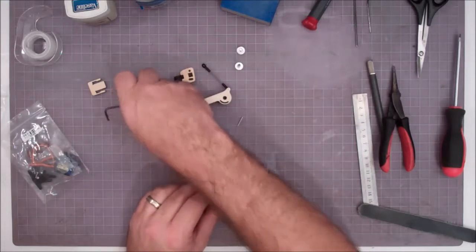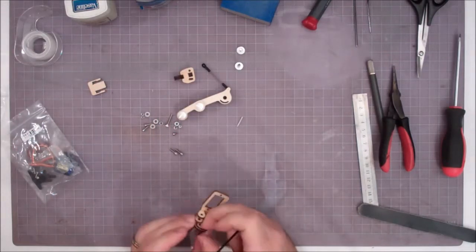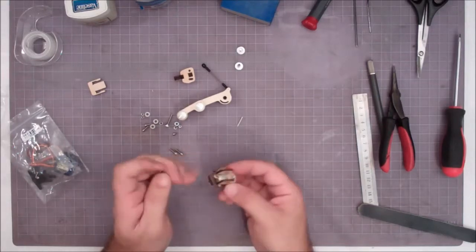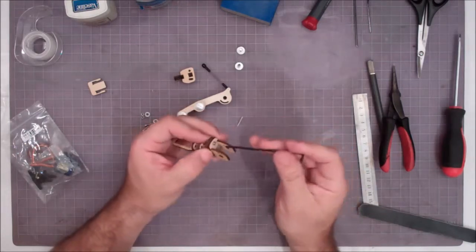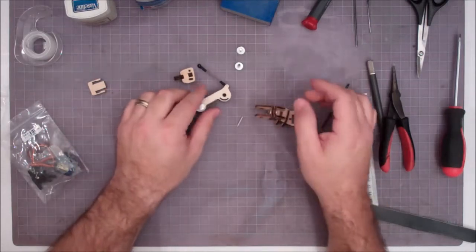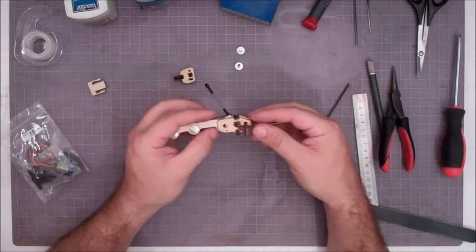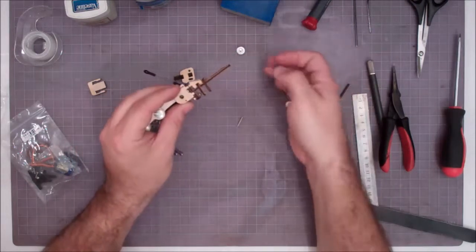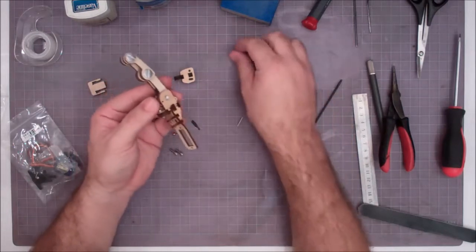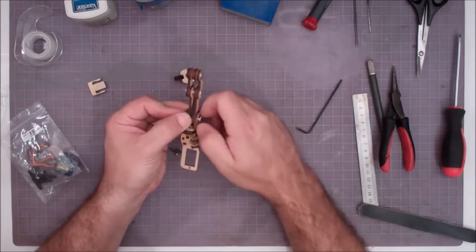And then we're going to take a washer and one of the nuts and assemble that whole thing together. This is our rotation lock, like on the fingers. The thumb has the same style part, and just tighten that down. Alrighty, now we can take the finger joint and slide it into the thumb base. We're going to take our final binding post here, sliding it in from one side, up through the middle, and through. Go ahead and put your other screw in to hold your thumb together.